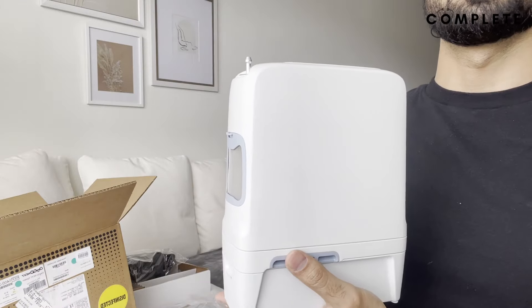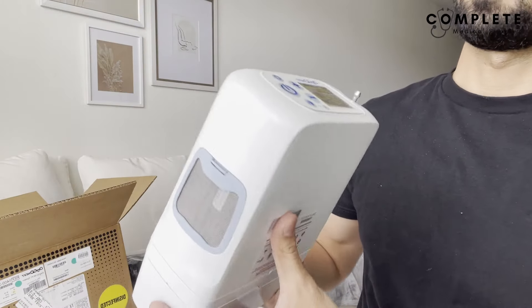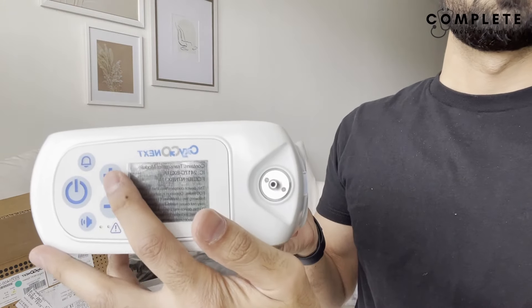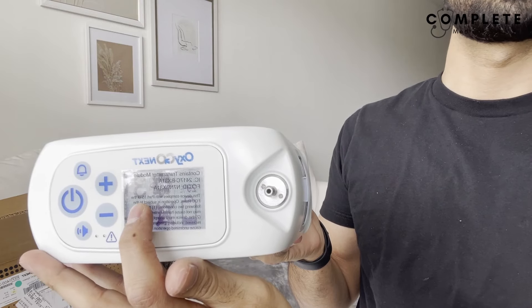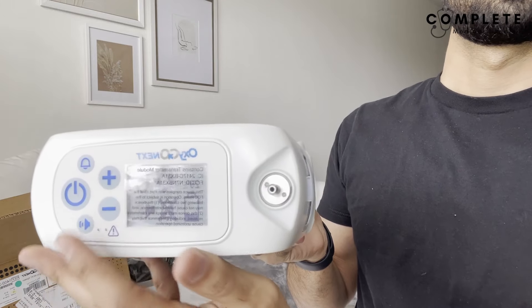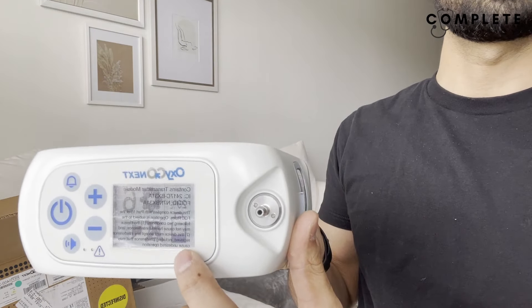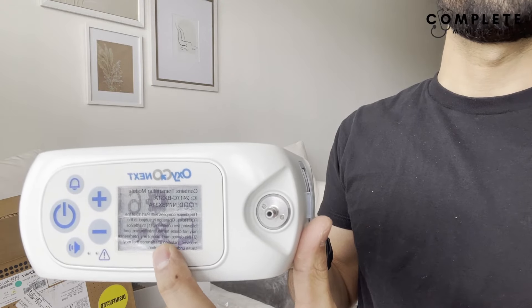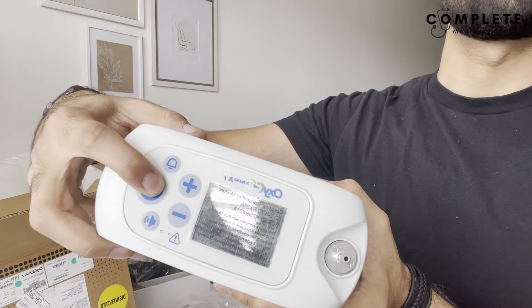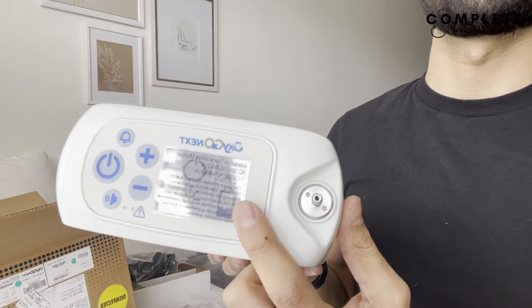Looking at the display, the plus and minus buttons change the setting from one to six. The screen shows battery life and whether the sound is on or off — there's a little mute button symbol. When you're ready to use it, the tubing connects to the output here. When done, hold the power button down to turn it off, make sure it's completely off, and then store it away.